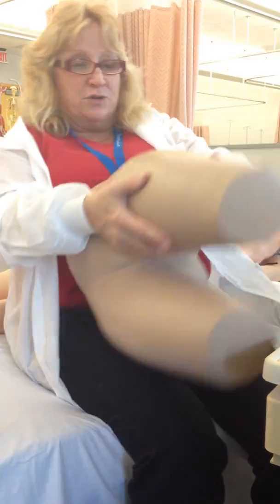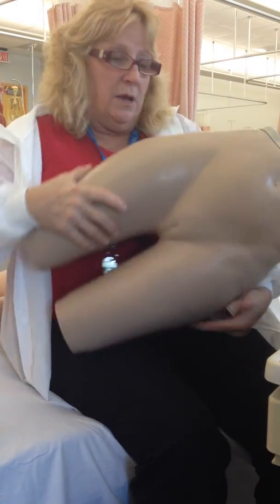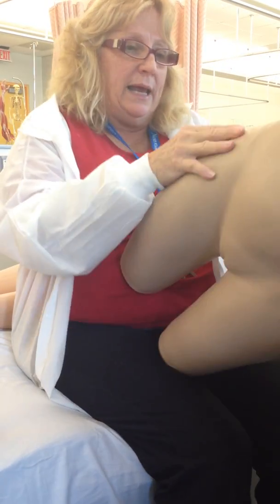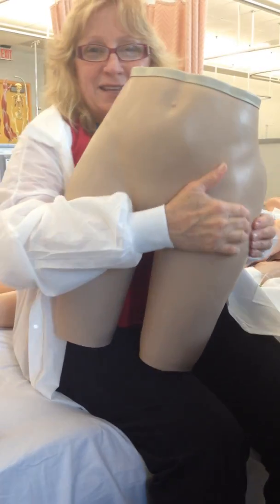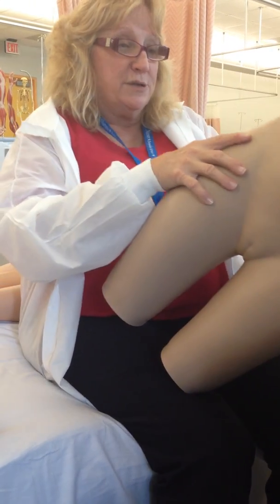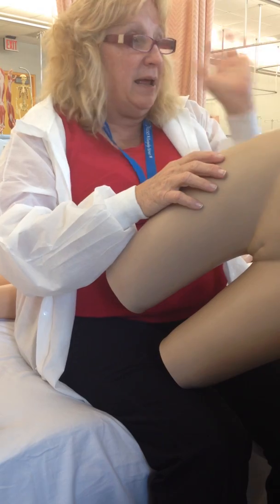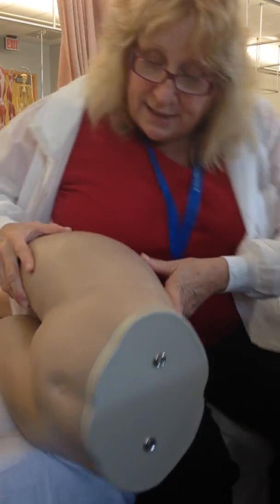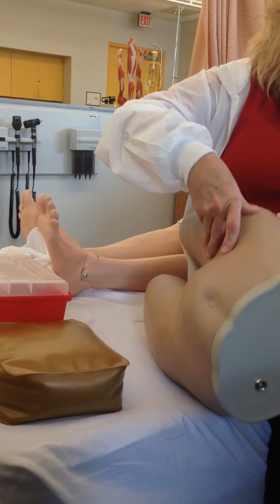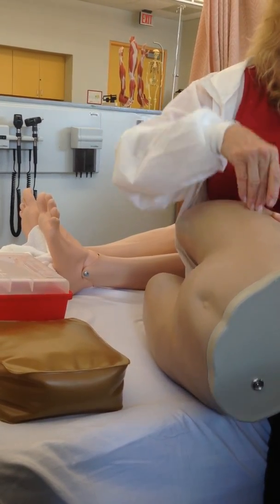Ariel, why don't you come and give us a ventral gluteal injection. Let me just reiterate how to find it. This is the mannequin's right leg. There's no femur in this side, so you're not going to be able to practice giving meds in the left ventral gluteal. So for testing, patient's right leg, your left hand finds the spot, and you're going to take two thumbs and you're going to feel for the head of the femur, and it's right there.